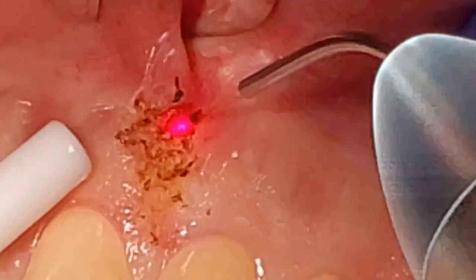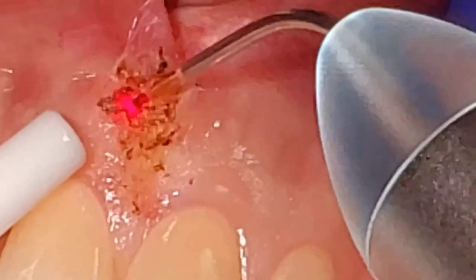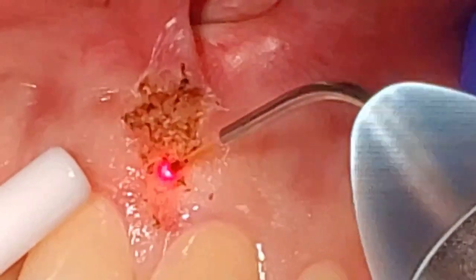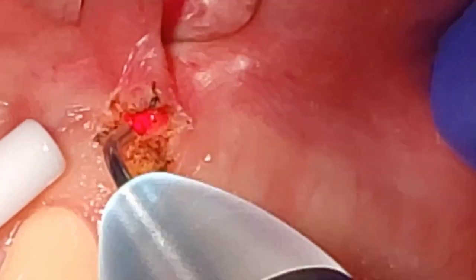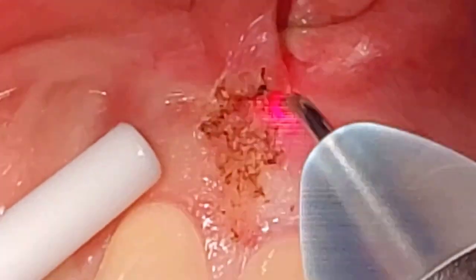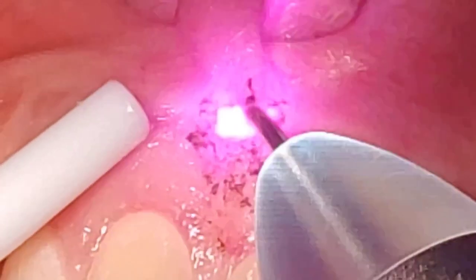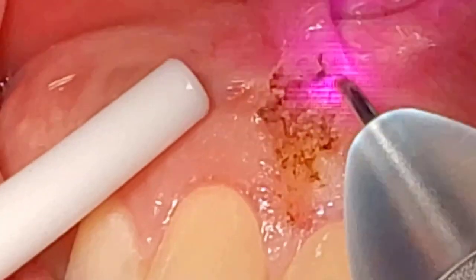Got some very, very tight muscle fibers here. So we want to make sure to dissect right down to that periosteum the whole way. You can see that the frenum opens up, pressing on the soft tissue on the periosteum. You need to feel that I am flowing that periosteum. And again, we're dissecting upwards. So at this point, we're about halfway through, and it's only been, I don't know, a minute.